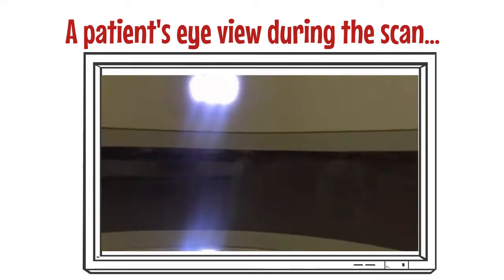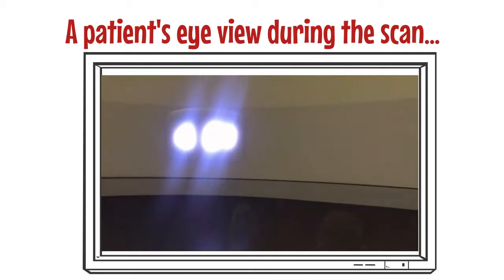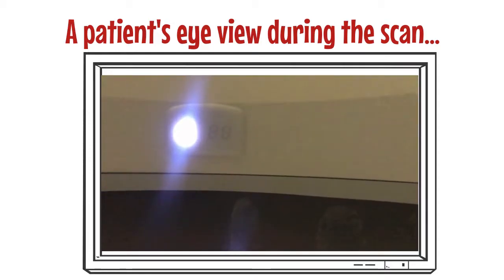You may be asked to hold your breath during the scan, and this will be discussed with you before the scan, and you will also be instructed when you need to hold your breath over the intercom system. In this clip, you will also be able to hear the sound of the CT whilst it's scanning. As mentioned previously, it is very quiet.